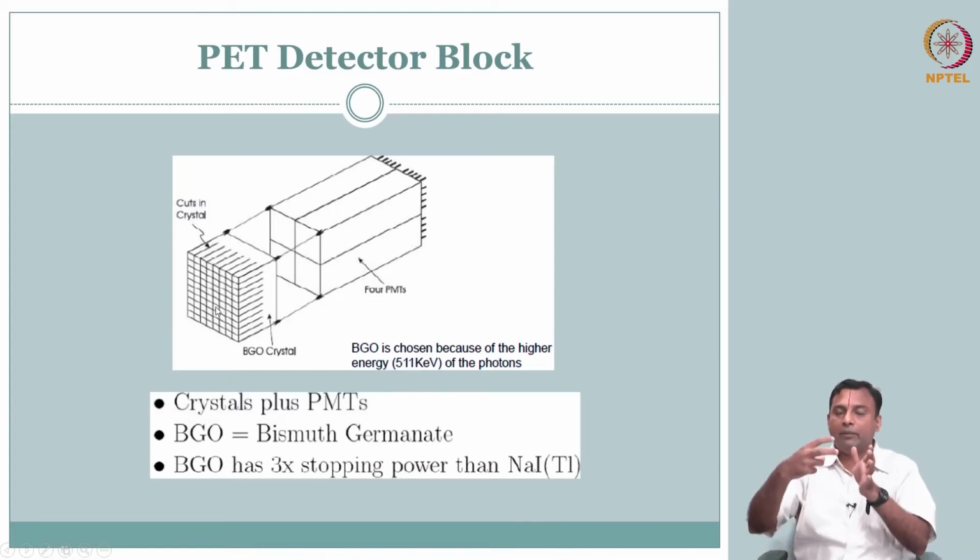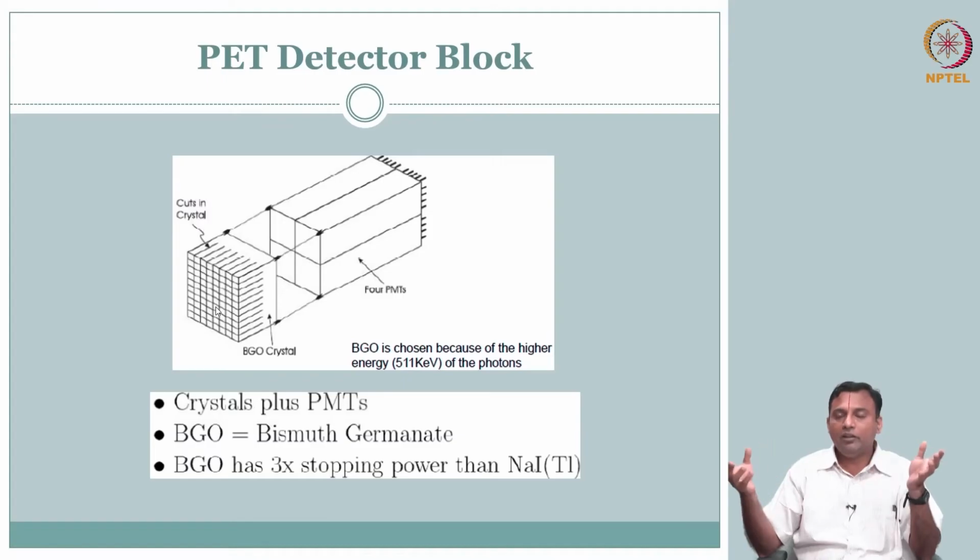You have a crystal and at the back of it your photomultiplier tube, and then we use this idea of x comma y, remember z pulse, so that we can get our x comma y localized by center of mass calculation. You could use that to your advantage, and therefore this is a nice combination.